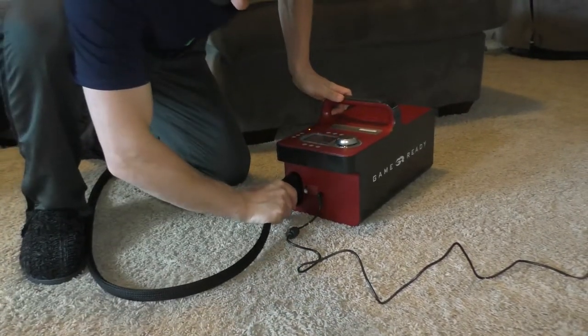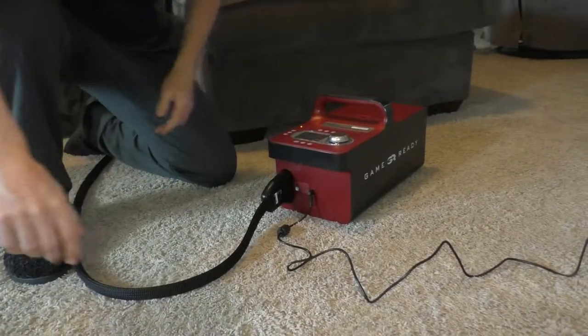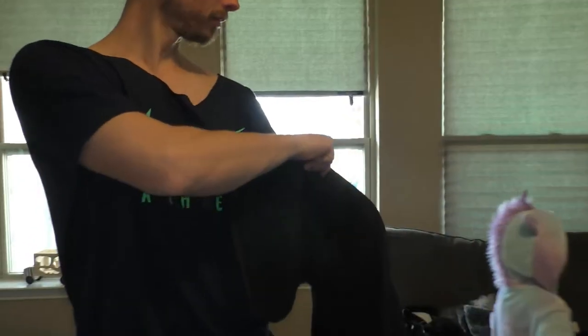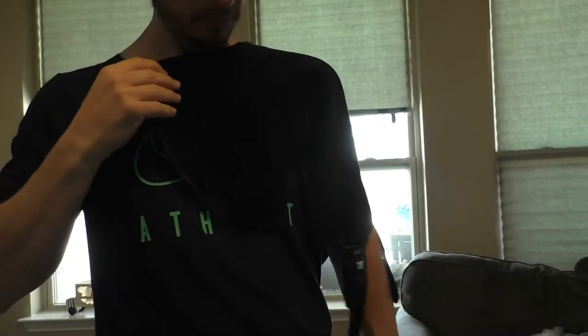Next step, connect the hose to the machine. Once you hear the click, connect the other end of the hose to the wrap or your sleeve — in my case, it was the shoulder sleeve.